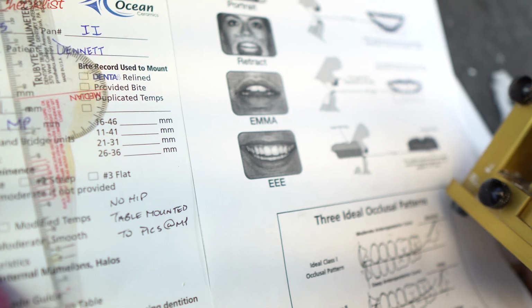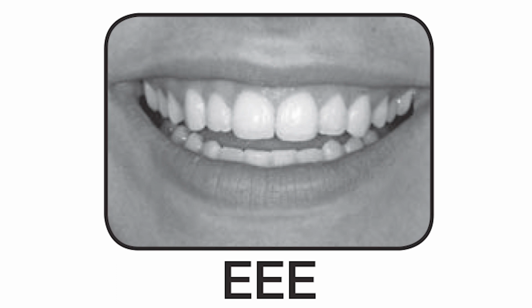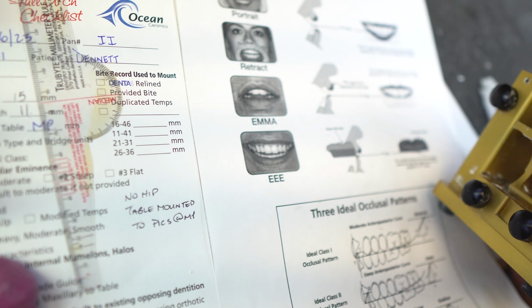And for some, it seems obvious, but not everyone. But techs usually never get this picture. And why it's important is we need to see how critical the gingival third of the teeth are. If we're doing implant work, we need to see how the gum architecture is, that it's complementing.